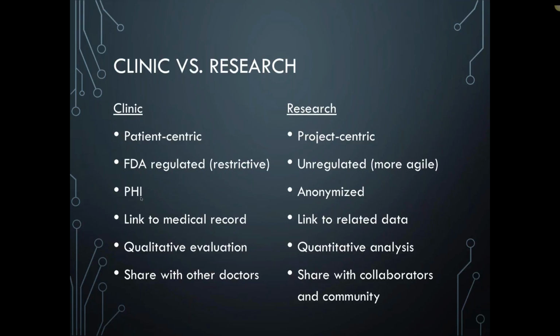The clinic is often more of a qualitative type of practice where a radiologist is providing their assessment of images by observation. On the research side, we tend to use a lot more automated and semi-automated quantitative analytics. And those are often quite computationally demanding.